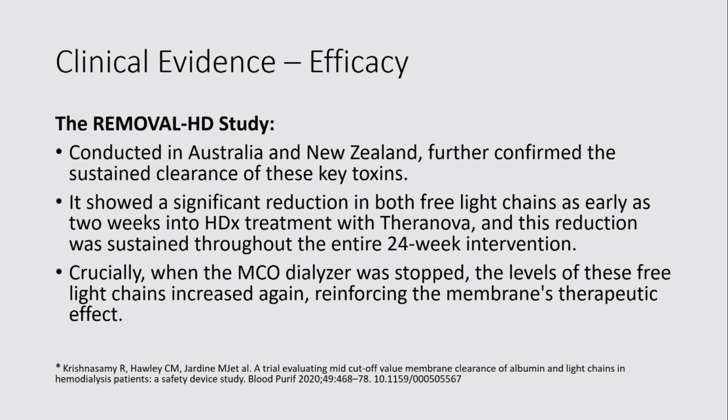Another study, which was not randomized, was conducted in Australia and New Zealand. It confirmed the sustained clearance of these toxins and showed significant reduction of both free light chains, kappa and lambda, as early as 2 weeks after starting HDX, that is expanded hemodialysis with Theranova.